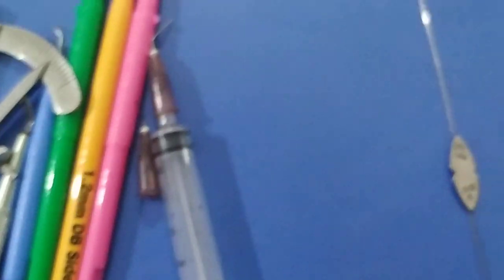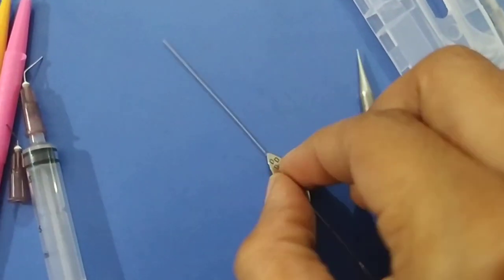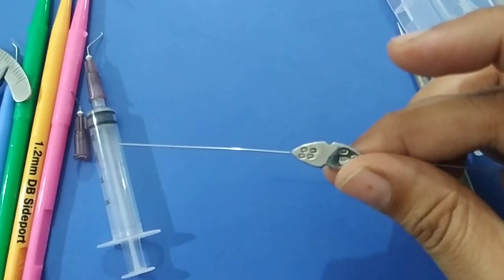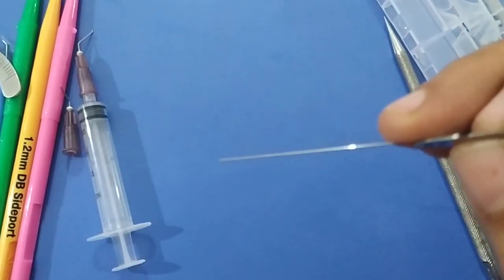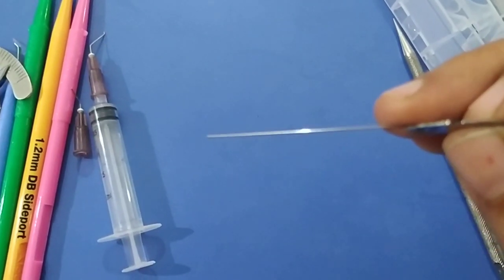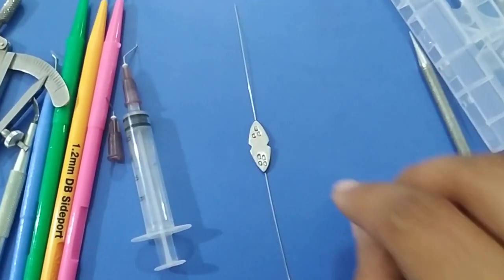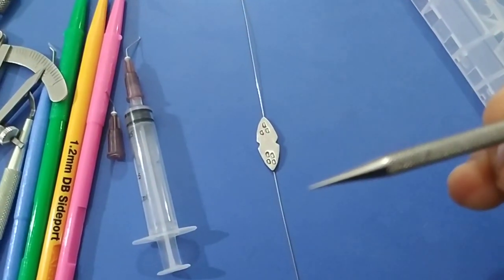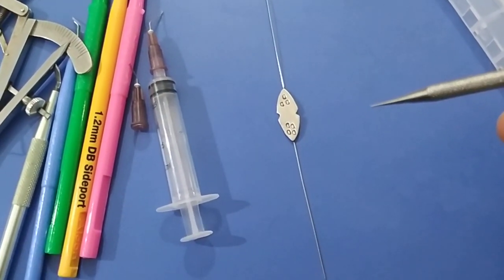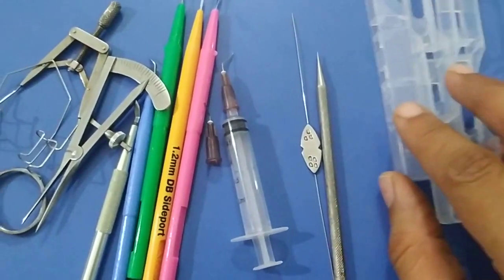This is a lacrimal probe and this is a Nettleship punctal dilator. The lacrimal probe comes in various sizes. The probe is used to cannulate the nasolacrimal duct and to open the soft stop in the nasolacrimal duct in pediatric patients. The Nettleship punctum dilator is used to cannulate or open the lacrimal punctum before DCR or DCT surgery, or as a diagnostic procedure.